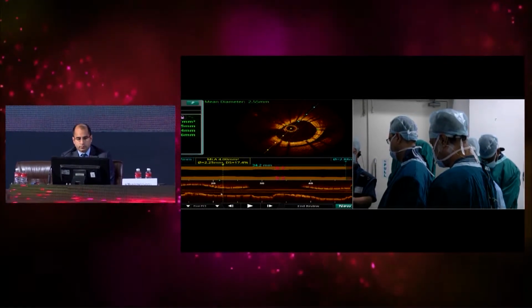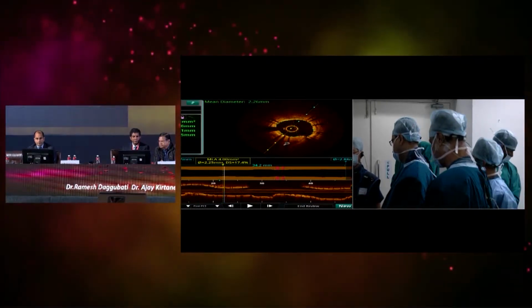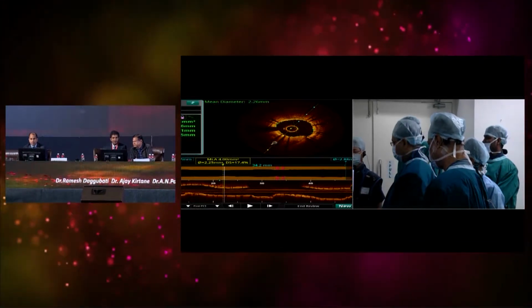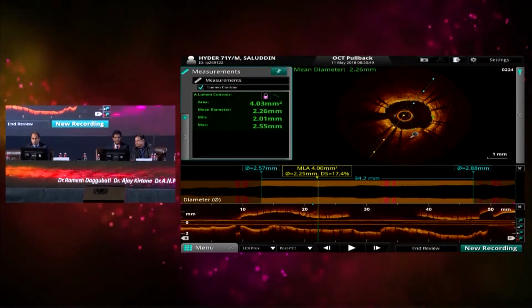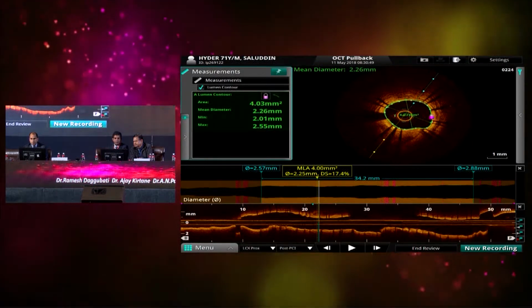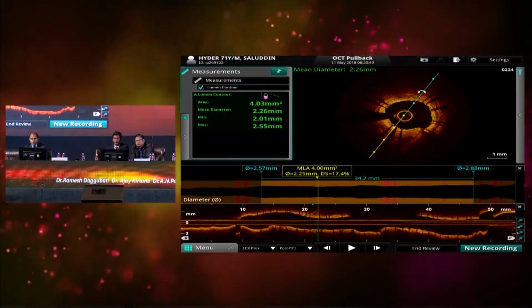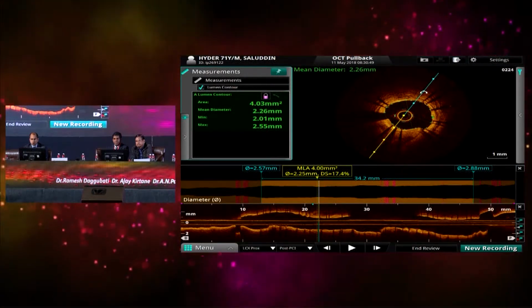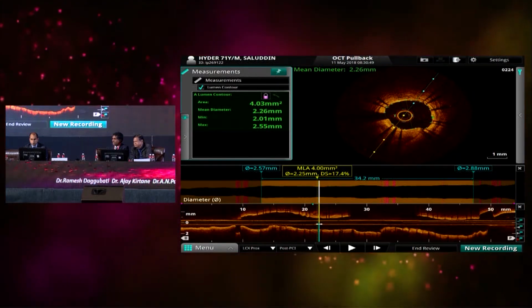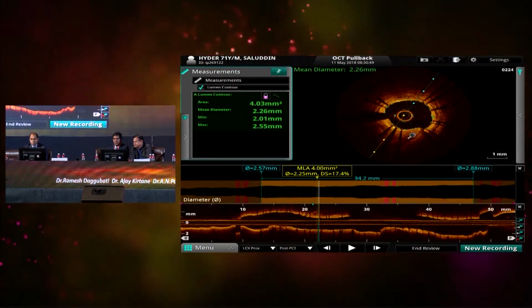This portion is a little bit small, I agree. But here is some calcium spot you can identify. Can you see here? Yeah, I can see it, but my concern is very thick, spotty calcium. If you aggressively dilate to the normal portion, it may cause some damage in the vessel, so we accept this condition. Only this portion is a little bit smaller compared with another portion, but if we think about vessel damage, it might be acceptable.